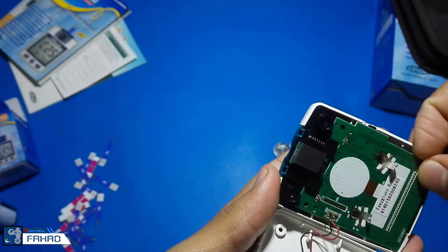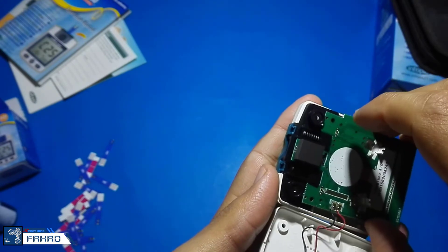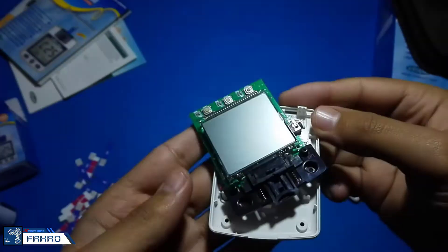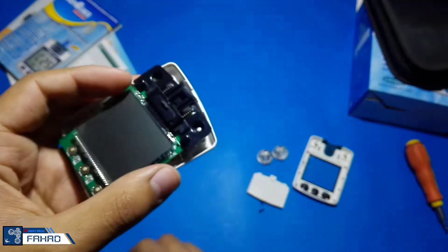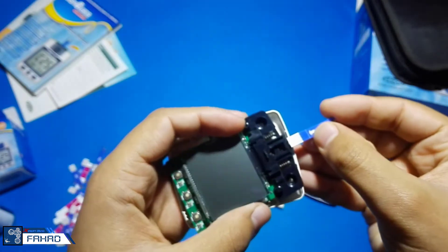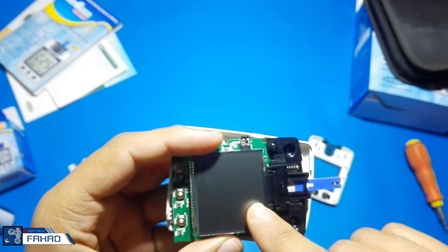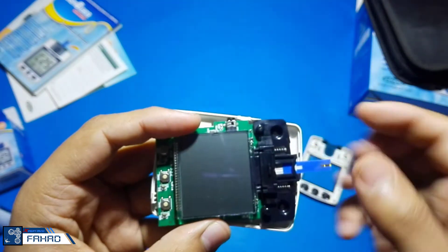Now I am going to remove the board from the front side. I removed it, and now you can see that it consists of a simple LCD and on the top side there are three switches. Now I am showing you how the strips go inside. After that I am going to remove this black cover so you can see the sensors clearly. The processor is below the LCD.